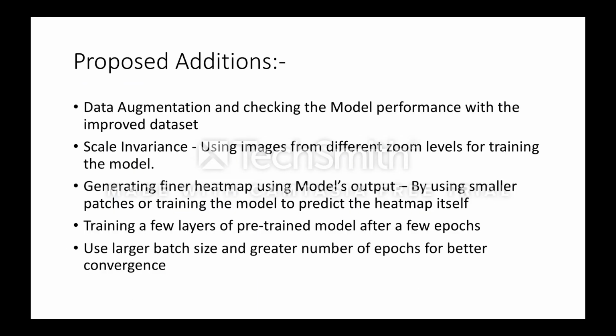There are a few additions that I thought of, but I didn't implement over here. First is data augmentation. I could have used images with different horizontal flips and created a larger data set, and again checked the model performance with the improved data set.